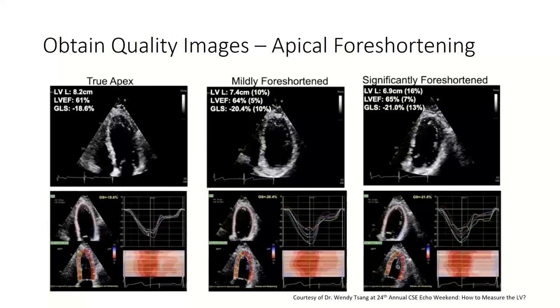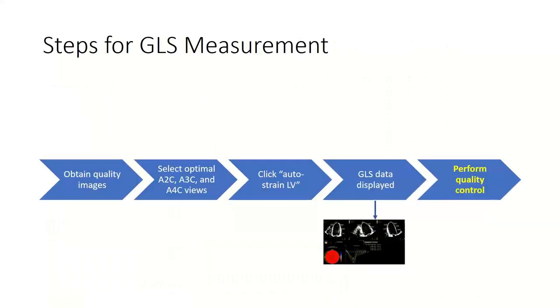The next part of obtaining quality images is avoiding foreshortening. When we image the true apex, we obtain a GLS of 18.6. But if we start to foreshorten — either mildly or significantly — we will start bumping up our GLS to above normal in a patient who actually has potentially abnormal GLS. So if you are going to perform GLS, just make sure you review for apical foreshortening.